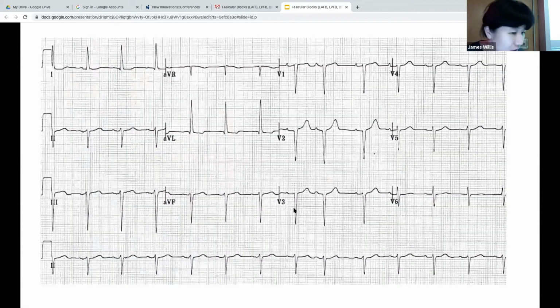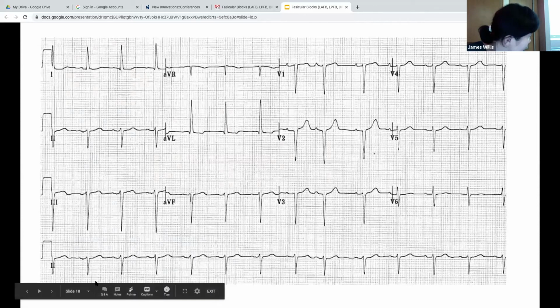We can go through this EKG real quick. This is the one that I showed in the beginning. That's basically just normal sinus rhythm. So you see the rate's about 100. We counted out maybe 300, 150, 100. And then there is a P wave for every QRS, and all those P waves are less than 1 big box, so you don't have an AV block. This is the normal interval. QRSs are narrow, in the normal range.